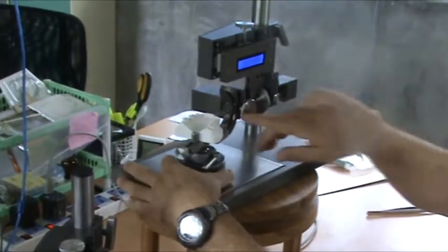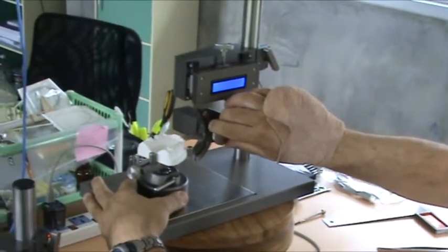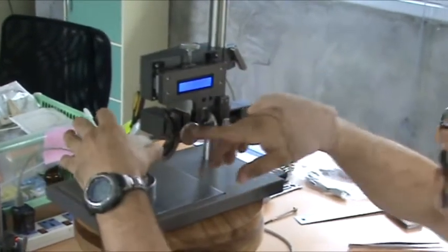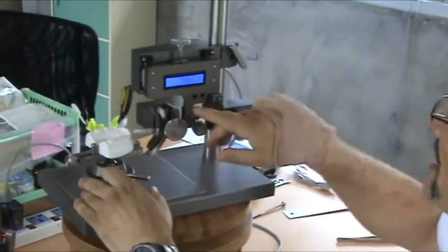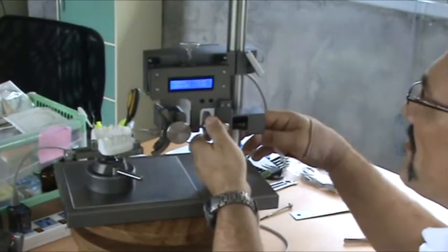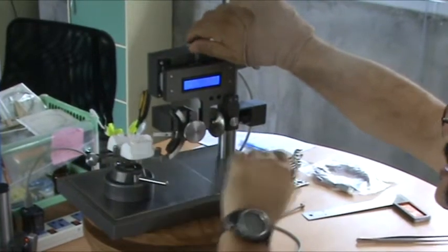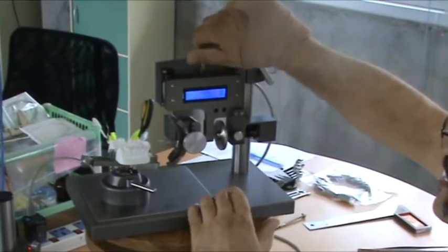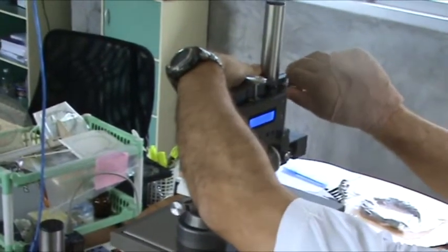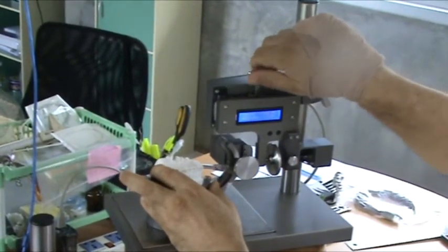Let's measure. If I want to set this tooth to a predetermined torque, let's say I want to set it to 10 degrees of torque, I want to increase that retroclination and change it to a positive torque, then I set, this is, let's say, zero. I want zero tip, 10 degrees of torque, I can do that. We just set the instrument and then change the tooth to fit the instrument. So now we use the survey base to fit the tooth to the instrument.